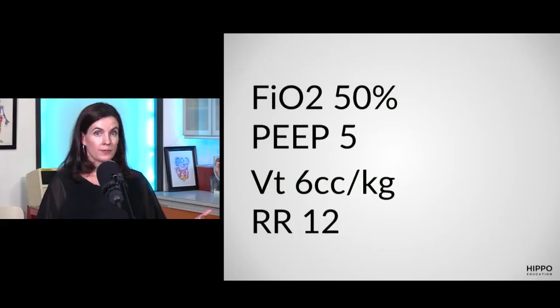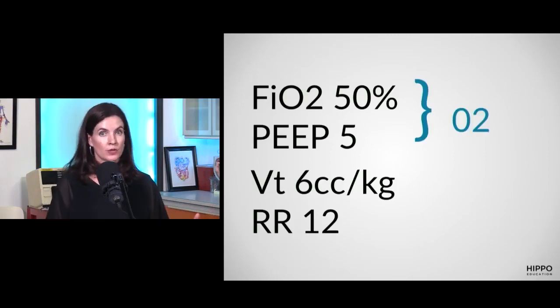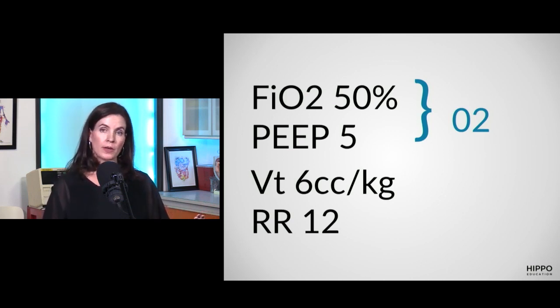Cool. All right. So to summarize that, when you have a hypoxia problem, your FiO2 and your PEEP are the components of your vent that you can titrate to help either turn your oxygenation up or down to the saturation that you want. I'm generally shooting for a SAT of 95 to 97. I don't go to 100 with very many people because I can make them hyperoxic, but anywhere in the high 90s I think is reasonable.